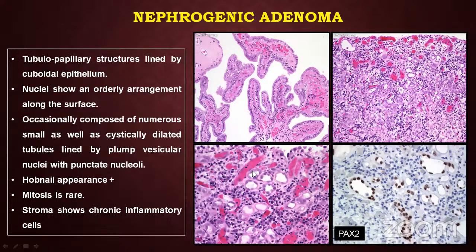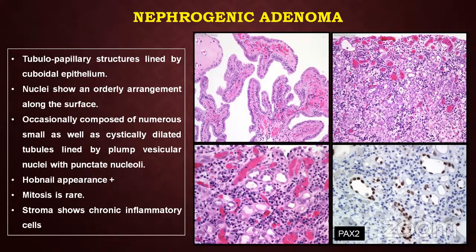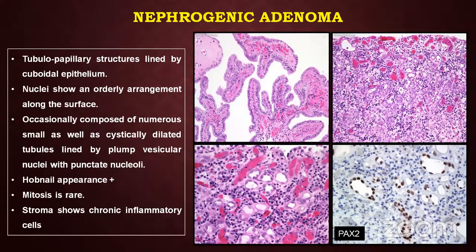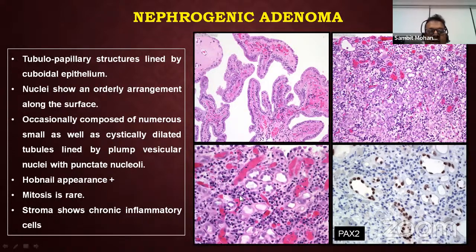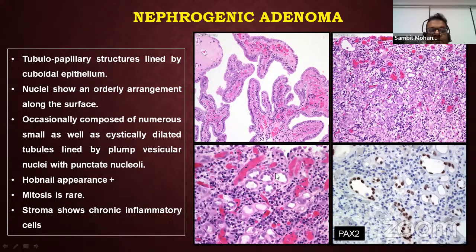Adenomyosis. What did you say, Sudhasmita? Adenocarcinoma. Yes, prostatic adenocarcinoma is a very good bet. Next one. Gleason 3. Adenocarcinoma of the bladder. Yes, vesical adenocarcinoma, number 3. You see this hobnail. Adenomyoma? No, adenomyoma is not a differential because we do not have anything supporting it.